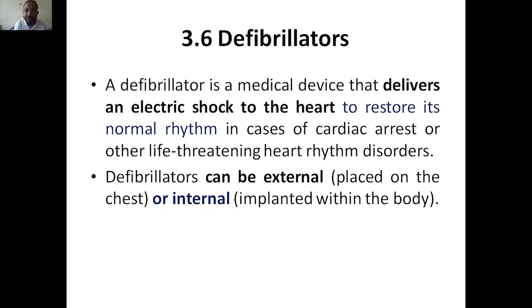So today we are going to discuss defibrillators. You might have seen in some movies, whenever the person's heart is not functioning, or the person is dying because of cardiac arrest, where they cannot use the normal pumping techniques with the hands, the doctors will use defibrillators. That means they will give a high voltage electric shock, so that the function of the heart can be restored to the normal rhythm.